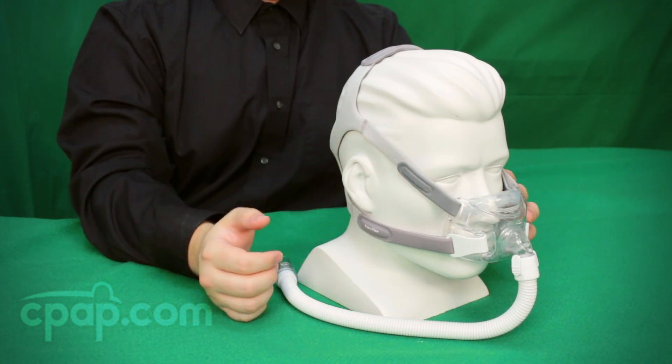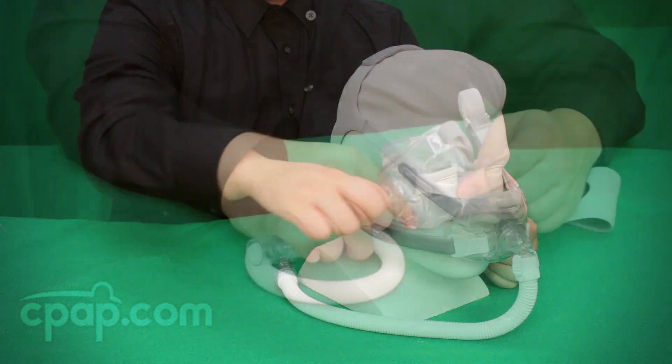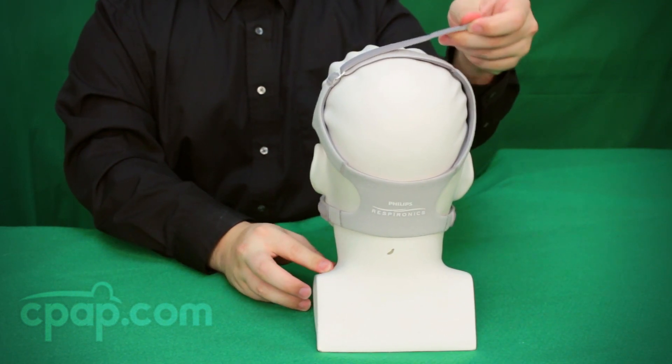The headgear connects at four points around the mask frame for proper support of the mask. The bottom two straps feature headgear clips which can be removed and replaced on the mask quickly and easily. The top of the headgear has a crown strap for a fifth point of adjustment.